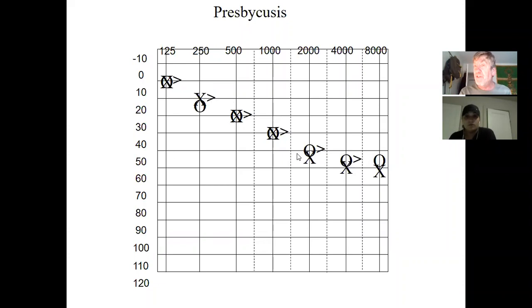Take the headband and put the sound through the bone, and the child's going to hear like a baby. Follow my cursor right along the top. Perfectly normal hearing through the bone, hearing loss through the headphones. Conductive hearing loss. It can get fixed. This one here, sensorineural.